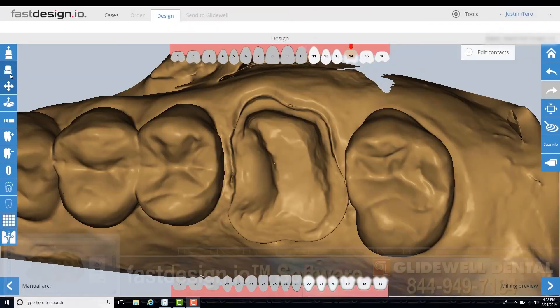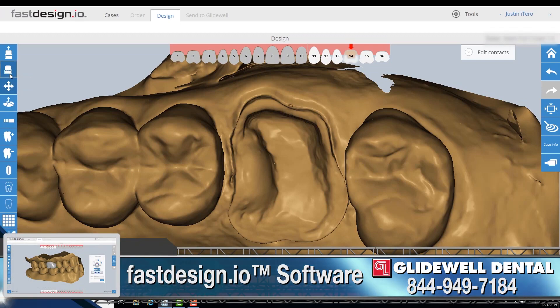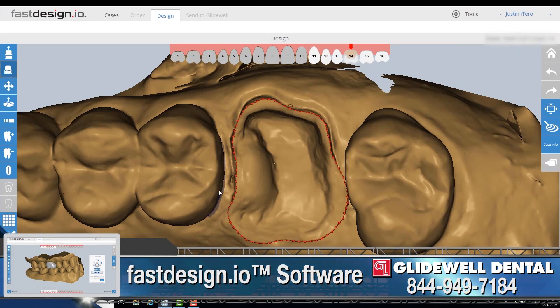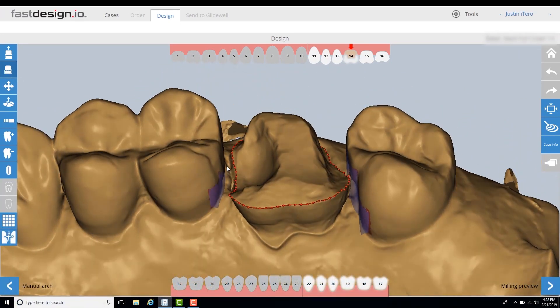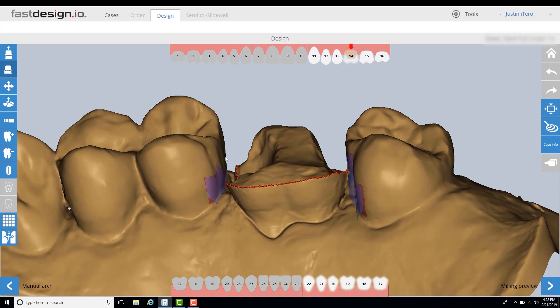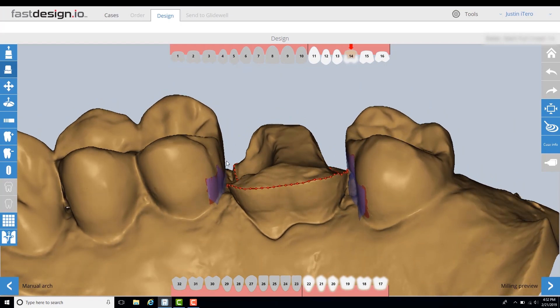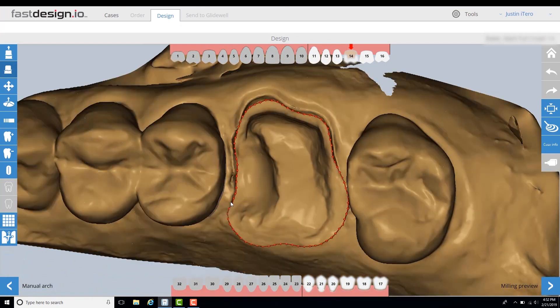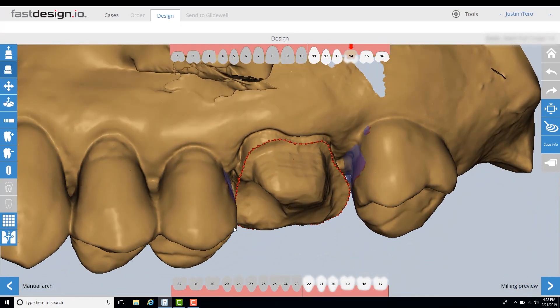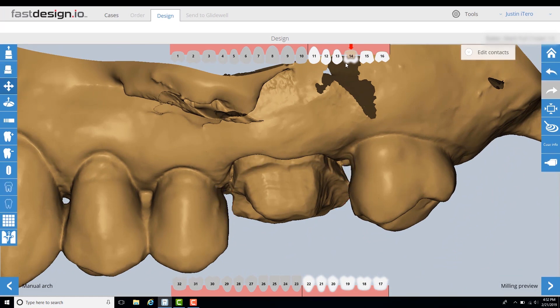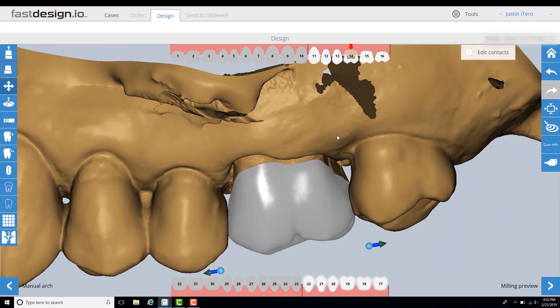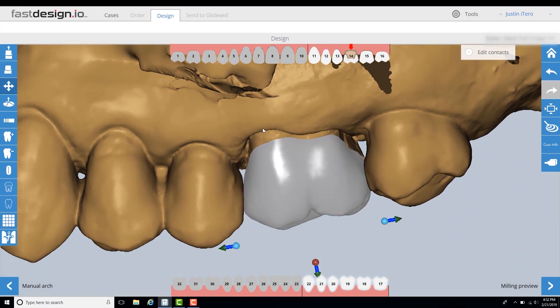The first step in FAST Design is to define the margins of our tooth preparation. When possible, I keep the margins supragingival so it will be easier to identify in the software. This step is straightforward as long as the clinical prep and tissue management are adequately provided.